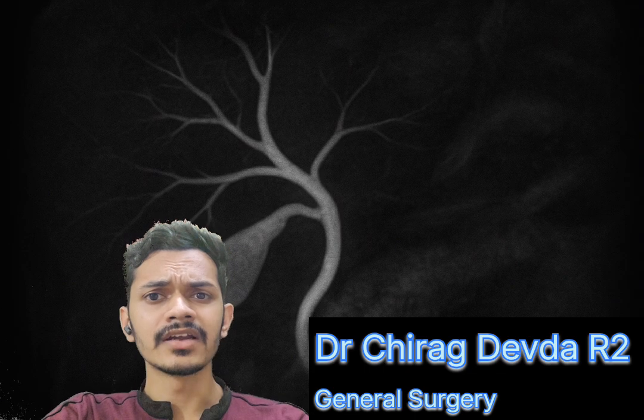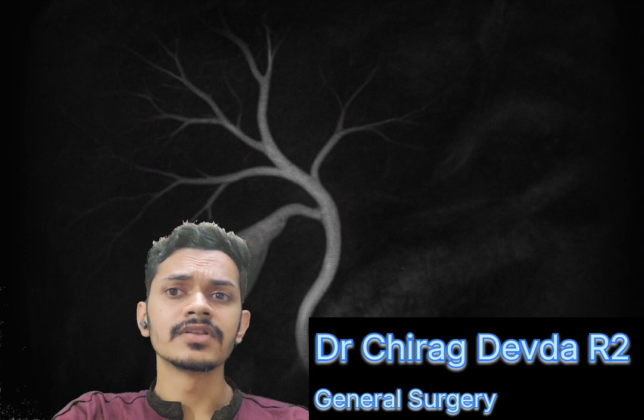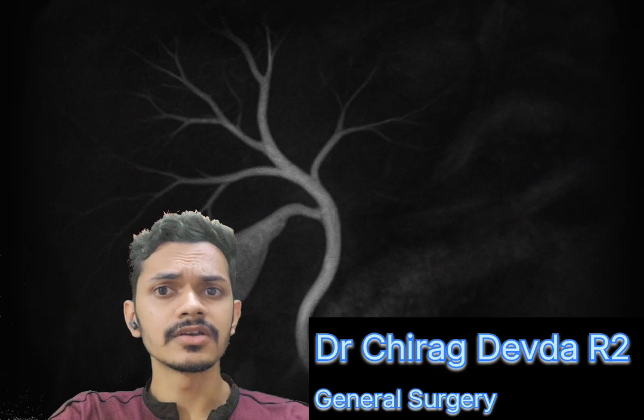In the pancreatic duct, it finds dilatation, stricture, divisum, communication with cystic lesions. In adjacent structures, the liver, pancreas and surrounding vessels are evaluated.